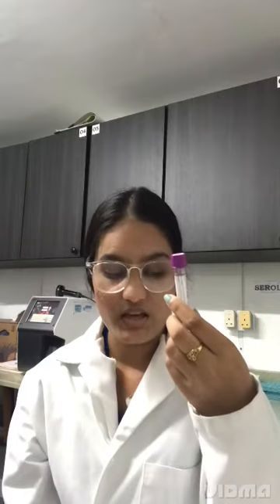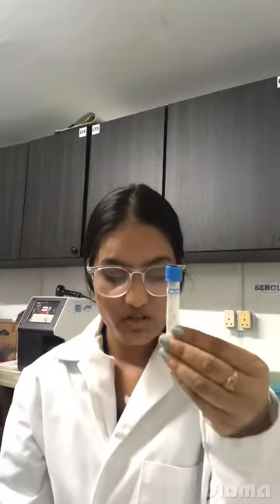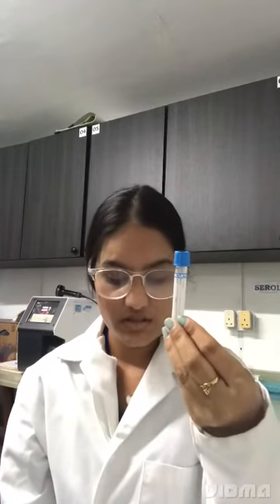We have the lavender or the purple top. It contains EDTA and acts as an anticoagulant, and this is used in the hematology department. The light blue top contains sodium citrate, which is an anticoagulant, and this is used in the coagulation department.